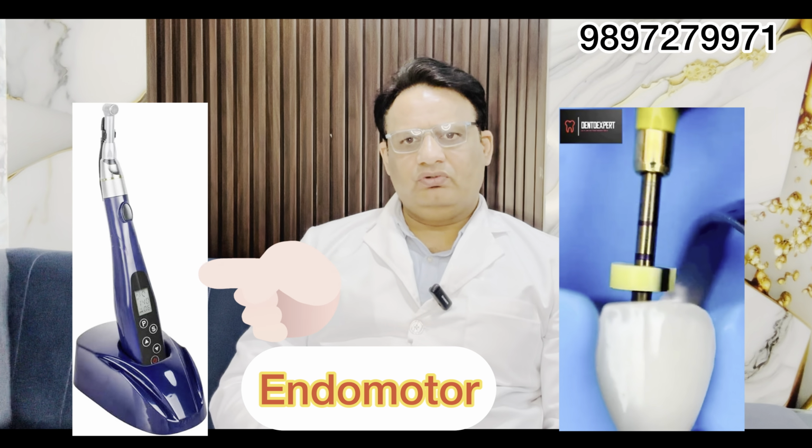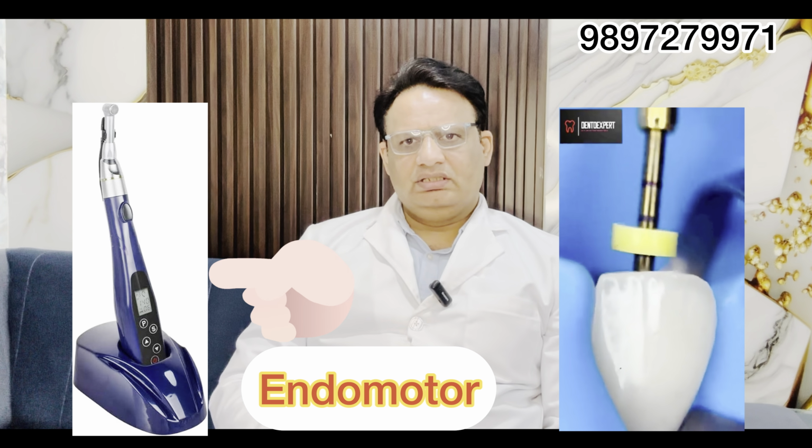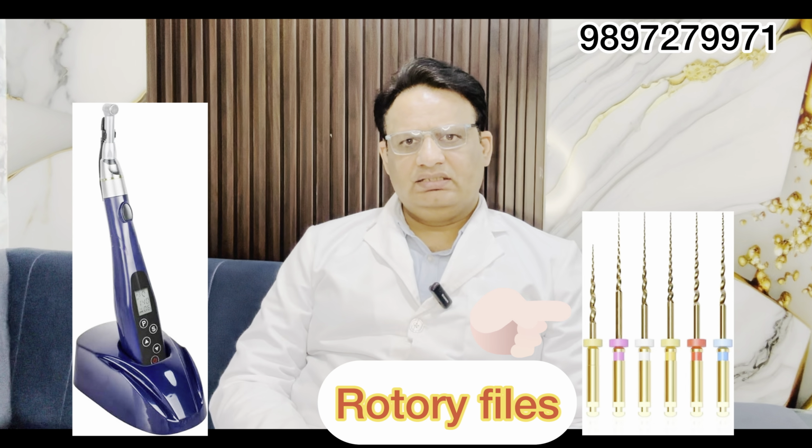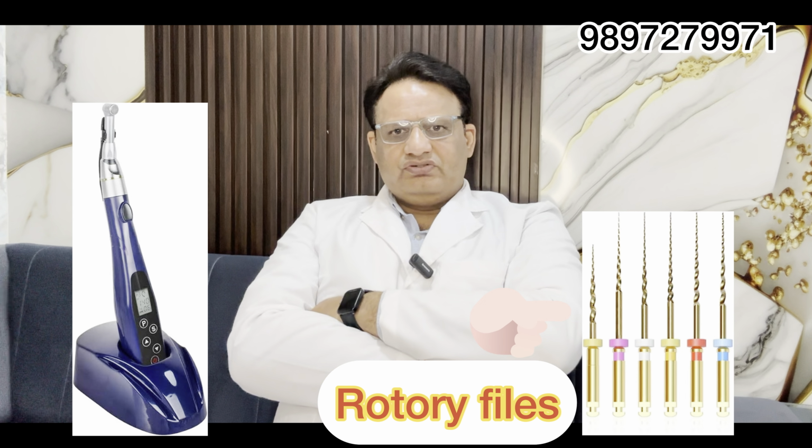After cleaning the canal with the hand file, we go for the endomotor, which is the latest instrument for the RCT. This is an instrument in which we use rotary files. The endomotor reduces the time of the RCT and gives a very good result after the RCT. It is far better than the hand file. So we finish the cleaning of the tooth with the endomotor.